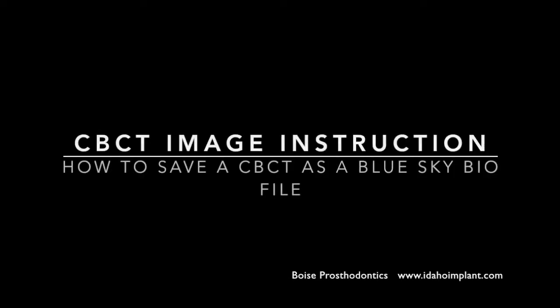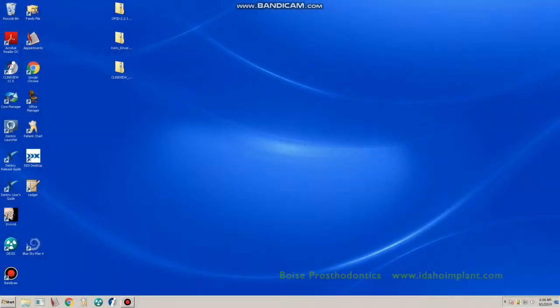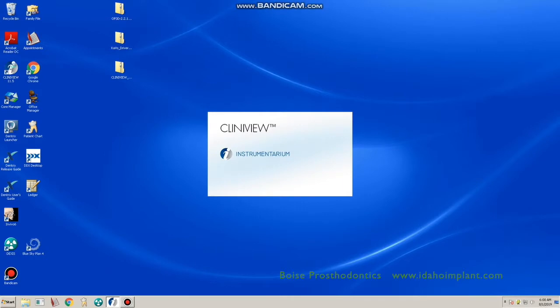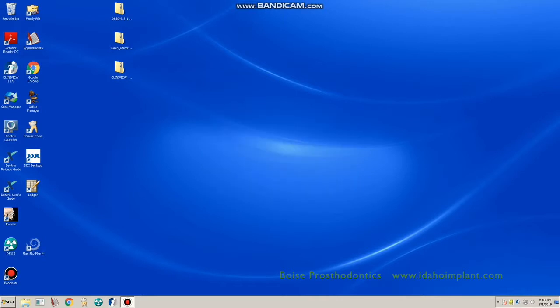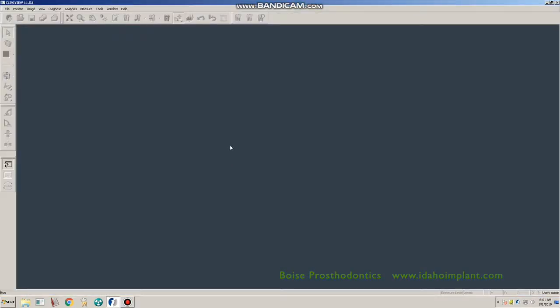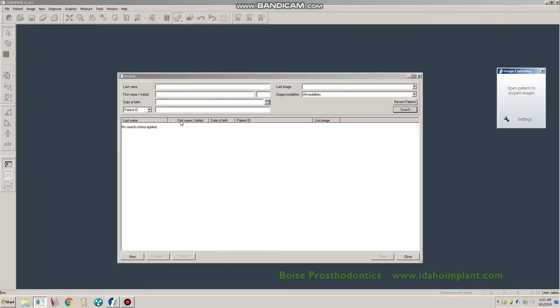This video will demonstrate how to save your CVCT as a BlueSkyBio file. Open your Cliniview software from which you have obtained a CVCT.